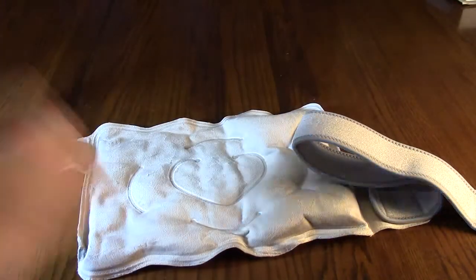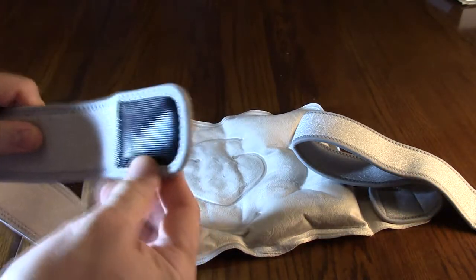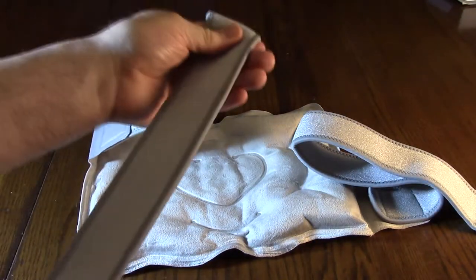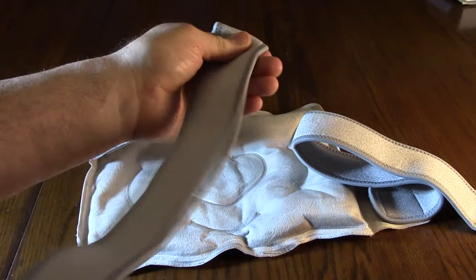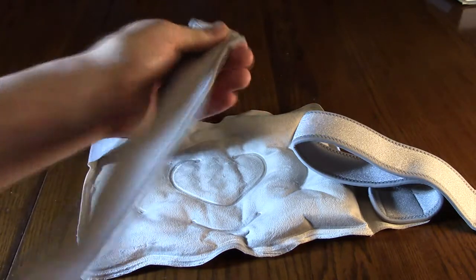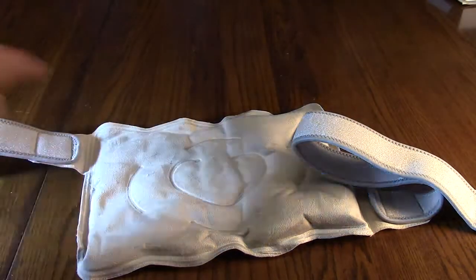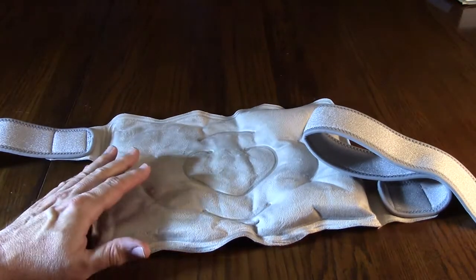It has straps with velcro, and these straps have a rubberized tension on them, which is nice. That's what's going to allow this to stay in place wherever you use it on your knee or your ankle.